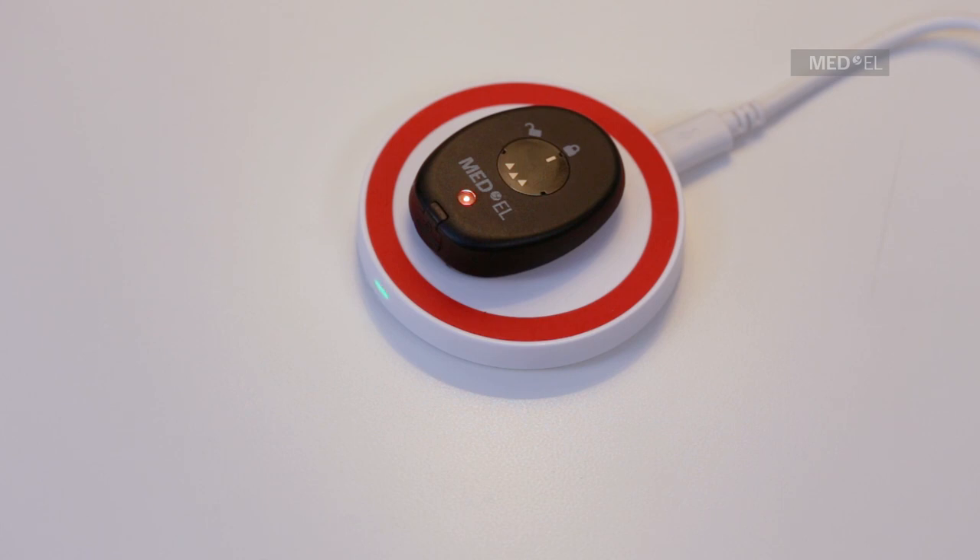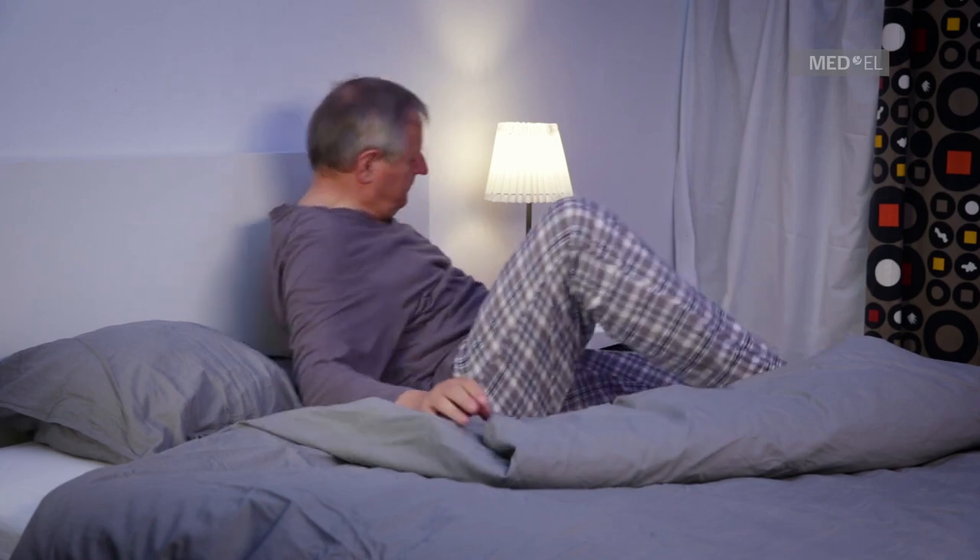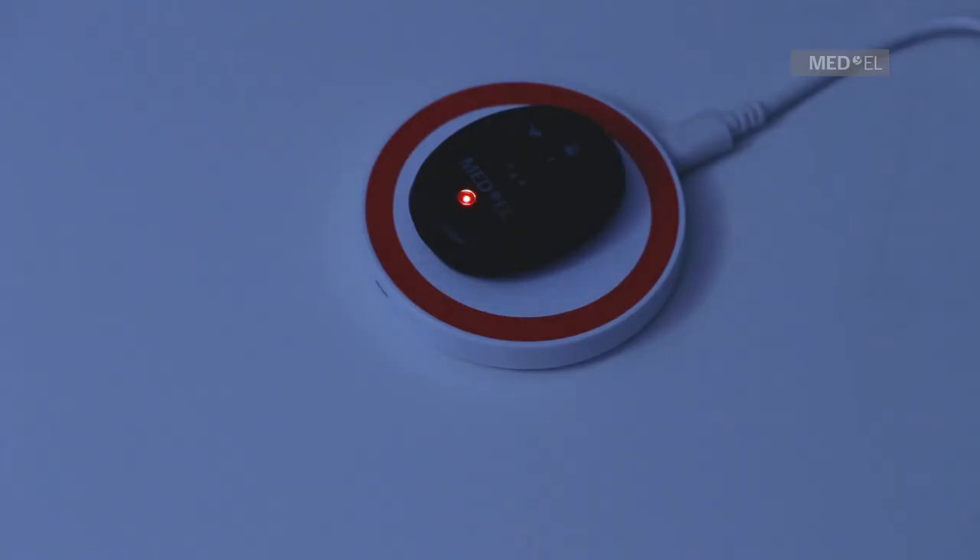When the light goes off, RONDO 2 is ready to use. This should take around four hours. We recommend charging your RONDO 2 fully each night.